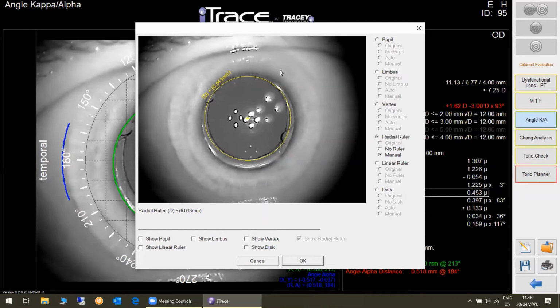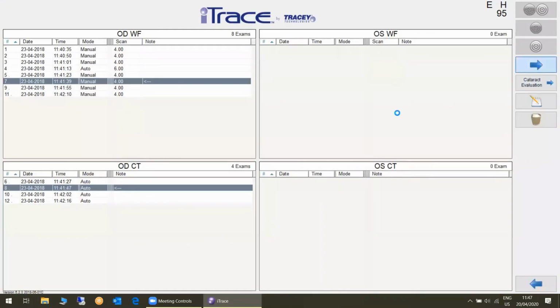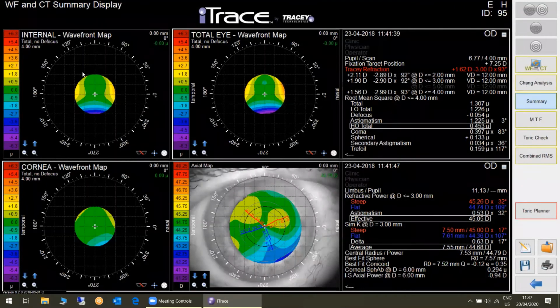Karel, yes? Just to add one aspect, if you look at the P4 reflex, they are not spherical, but oval. This is tilt. This is an unfolding IOL, because the P4 is oval, not circular. This one was compressed, and I can show you that it was compressed by this. You can see it here. This is compressed. I will show you a tilted IOL later on, and this one is compressed.